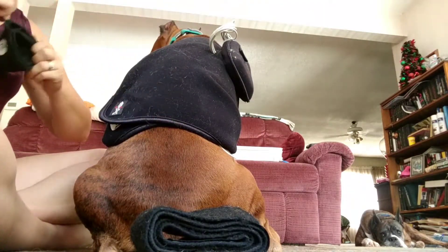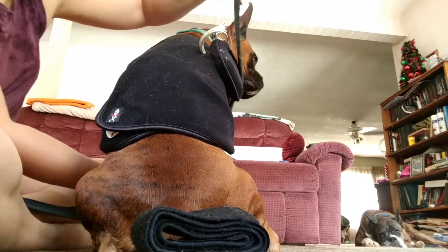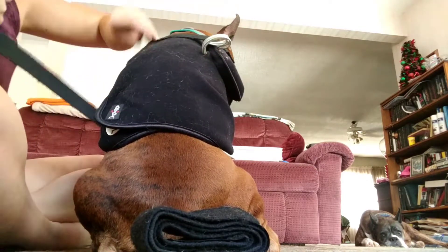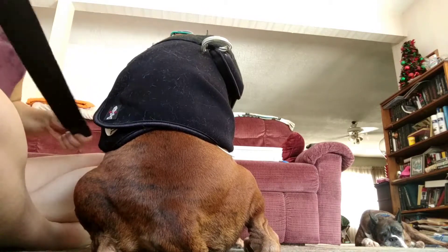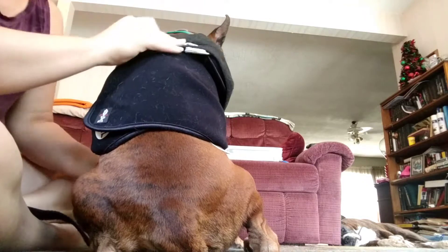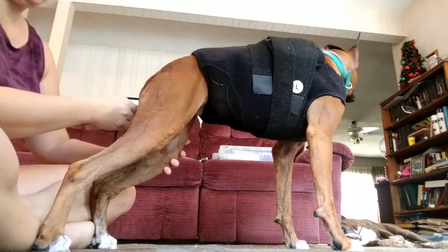There are straps — this is velcroed here and this is velcro, but it's a loose easy velcro so these hold it at the top. Wrap it around and back onto itself, velcro it closed, and then velcro it back onto the bodysuit. Then do the second strap the same way, just a little further down. Once you're done, it should look like this — this is what you should successfully end up with.